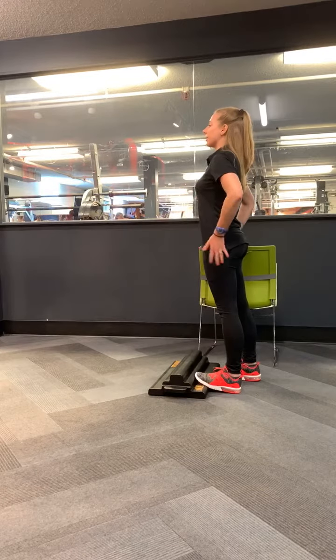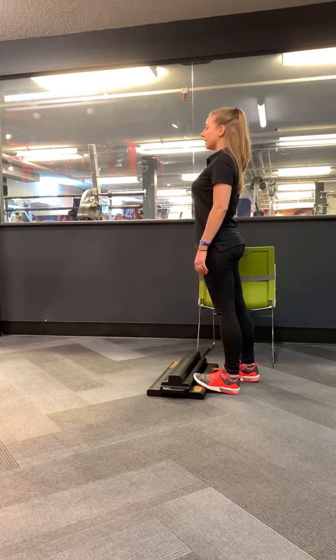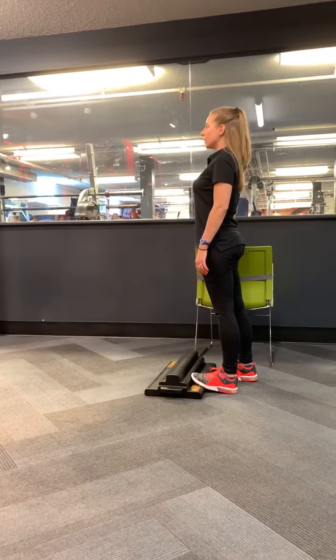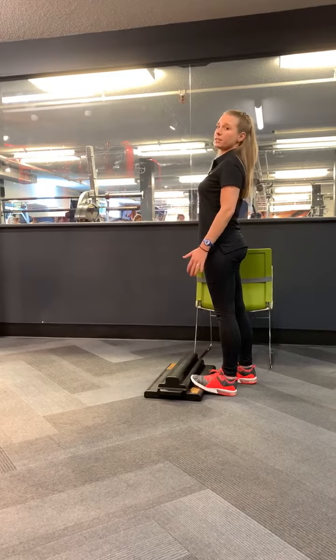Again, make sure those legs are nice and straight. Kind of push those hips forward. Keep your shoulders back. Stand nice and tall. As you move through these phases of gait, don't forget that your chair is there to assist you at all times.